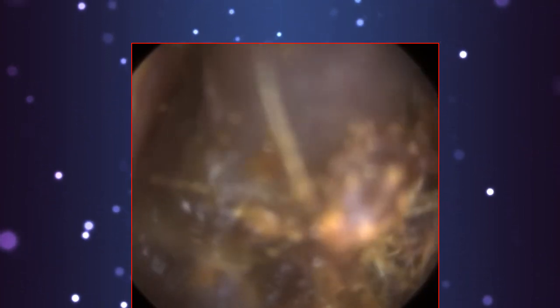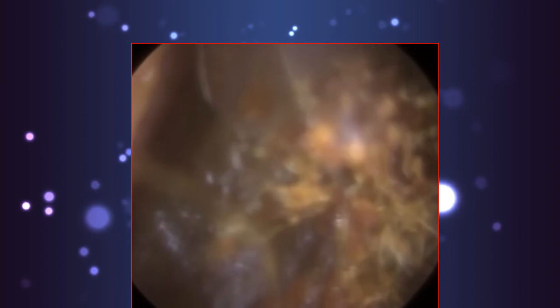So near the end, I managed to bring this wax plug forwards a bit onto the cartilaginous portion, could create an opening at the top, and I then used a hook to glide in at the roof of the ear canal and turn the hook and then bring forwards. If I was to put a hook now and do that at the top, it would probably make contact with the eardrum. It would be very uncomfortable.